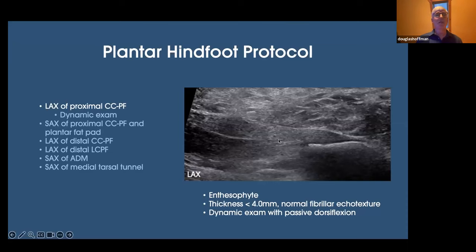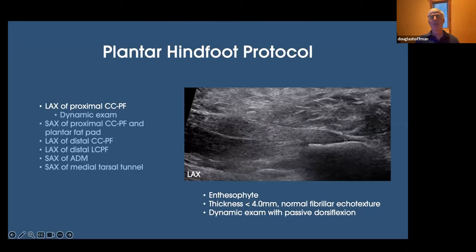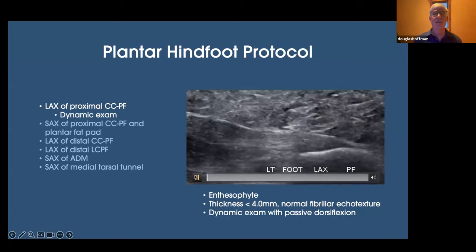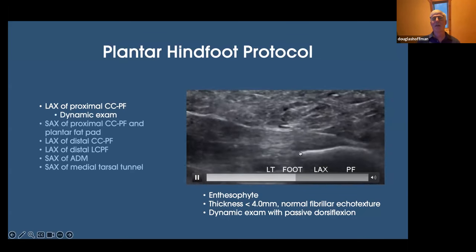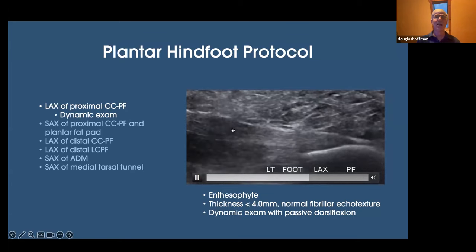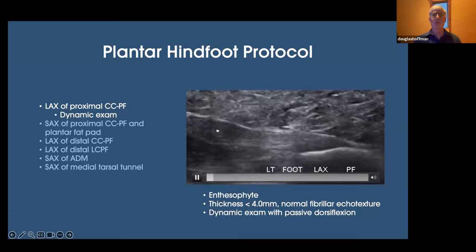This is the first image in the protocol — a long axis image of the proximal central cord at its enthesis. I'm scrutinizing the surface of the calcaneus. Here we see the enthesiophyte. Our patient has a relatively normal proximal central cord with normal fibrillar echo texture. There is an abnormality at the junction of the proximal and middle third. Part of my protocol is a dynamic exam where I passively dorsiflex and plantar flex the ankle. With this patient, it was fairly normal, but it's not uncommon to see undersurface tears corresponding to the enthesiophyte. Even our abnormal area tensions nicely during the dynamic exam.